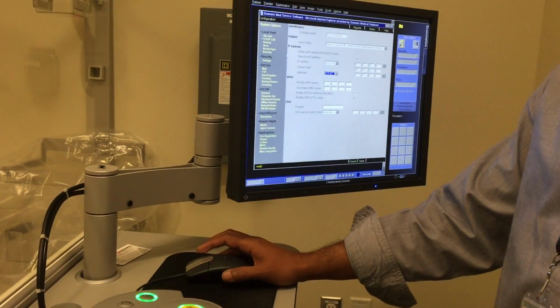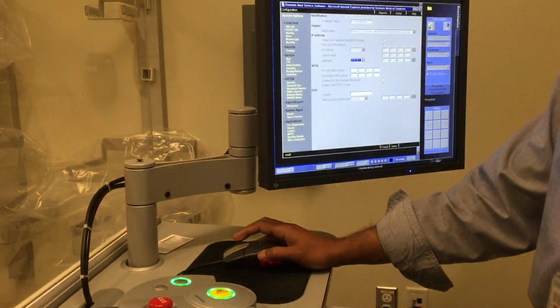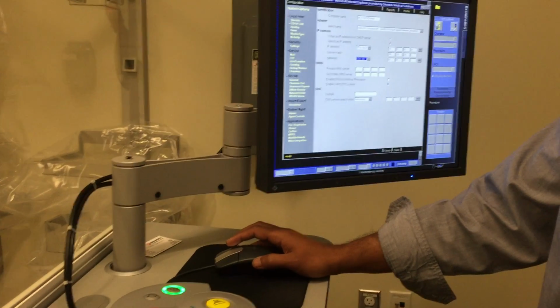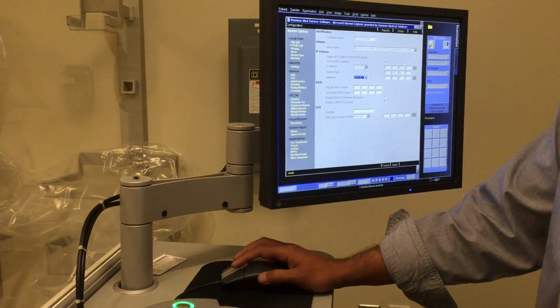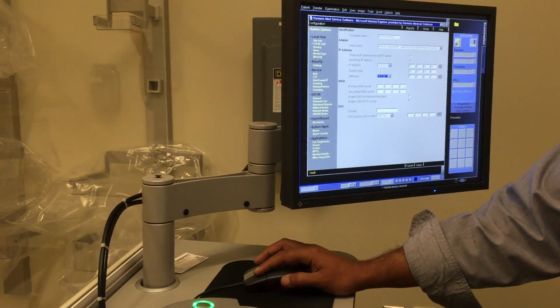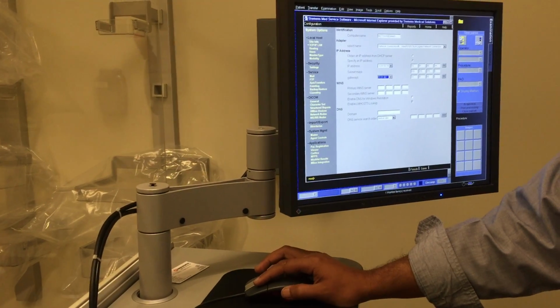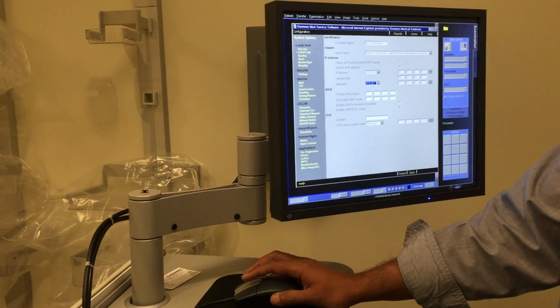PACS support. There are two types of individuals who look after the IT: the site IT guys, IT support. They provide those IP addresses, and then PACS helps us to set up the IP addresses in the DICOM. PACS is in this case Marvin.